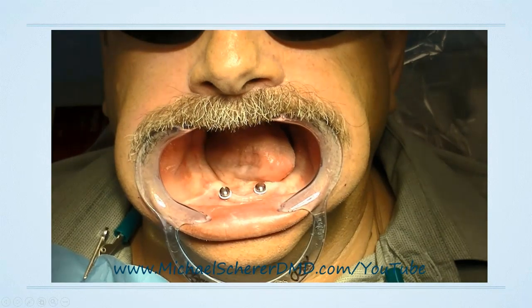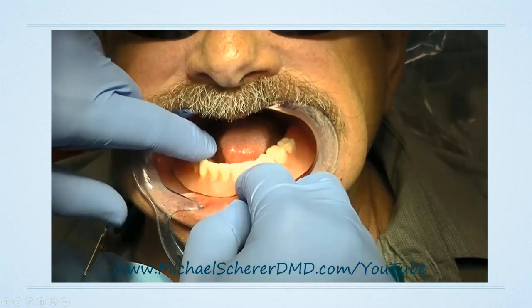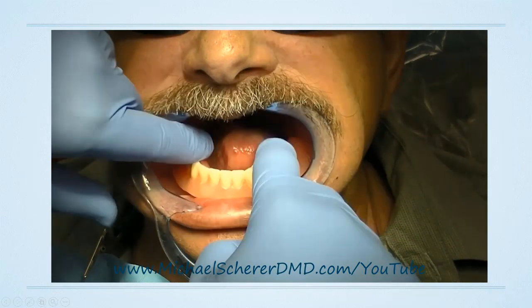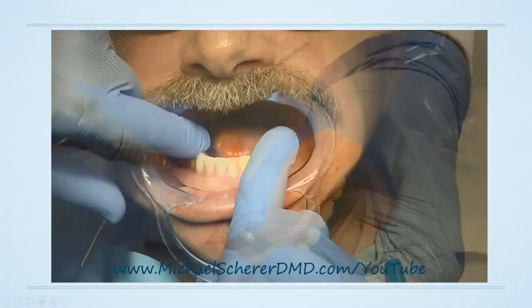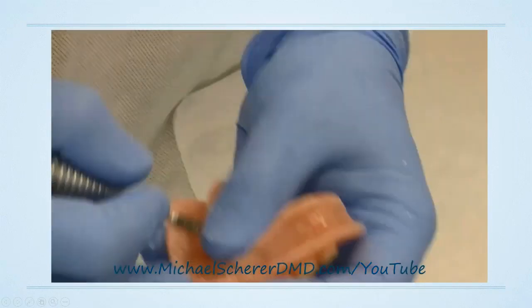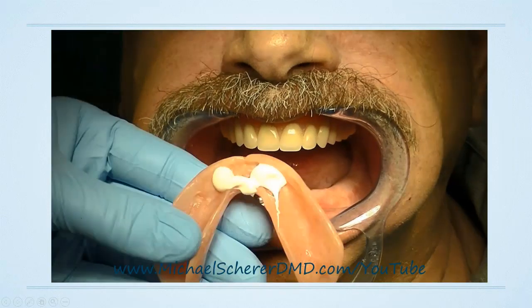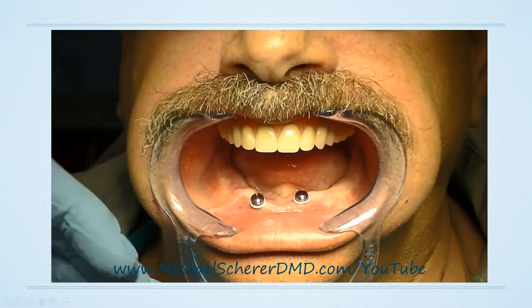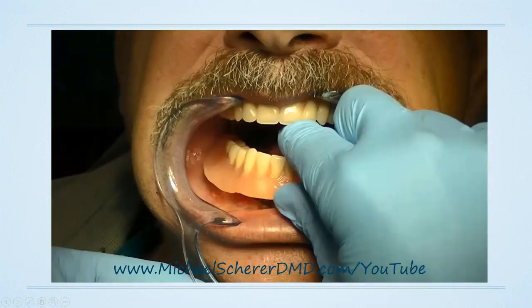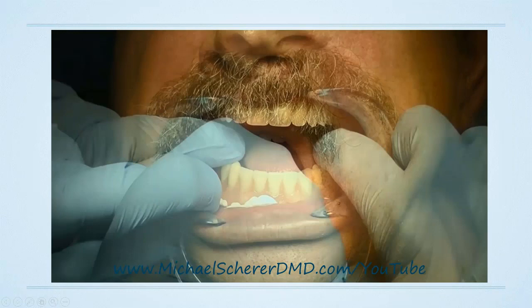Now what we're going to do here is try that denture in again, verifying that it seats down all the way. And now what I need to do is just size my recesses. To size the recesses properly, I use either the denture prep and polish kit or any commercially available acrylic burrs. And then I like to utilize a PVS-like material.